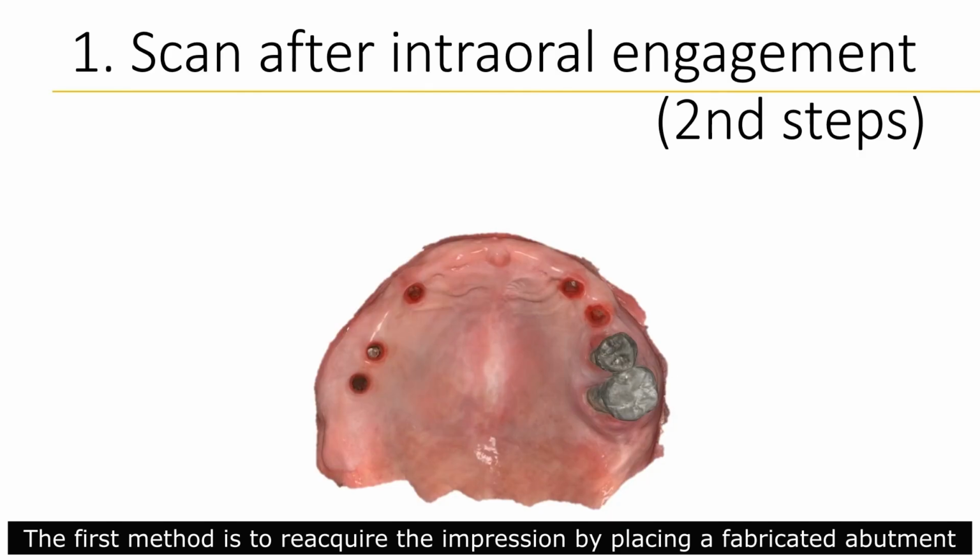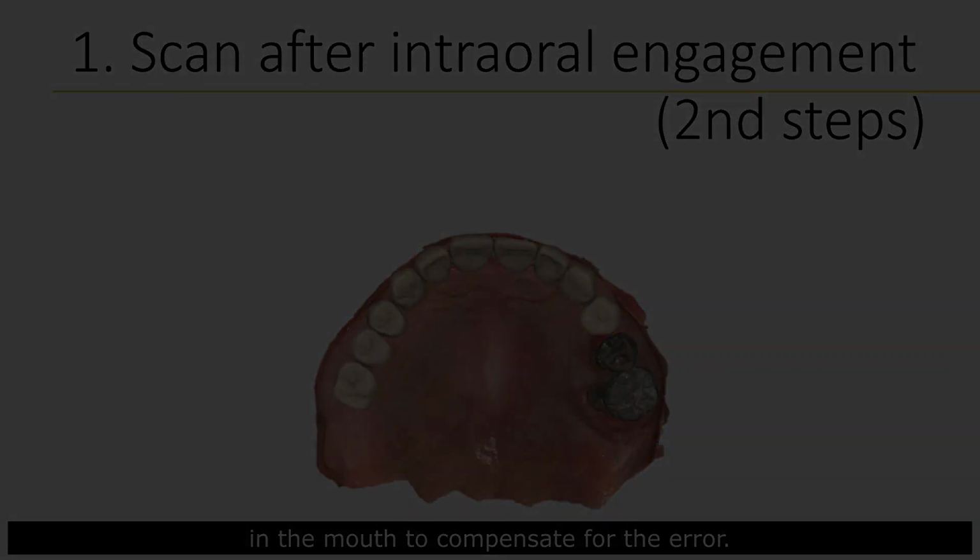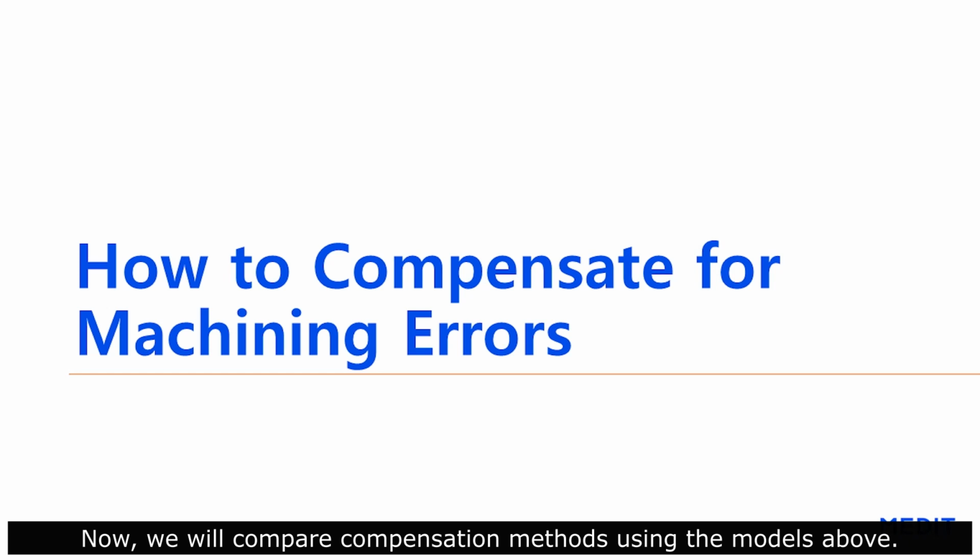to reacquire the impression by placing a fabricated abutment in the mouth to compensate for the error. Now we will compare compensation methods using the model above.